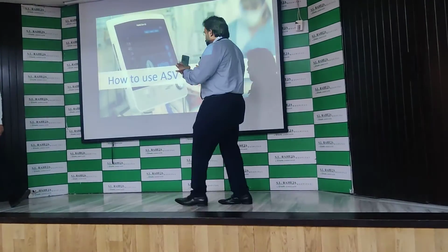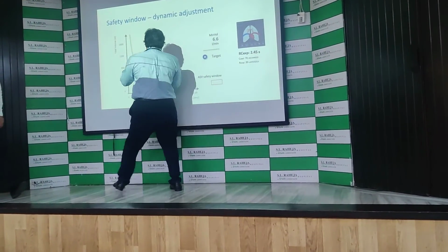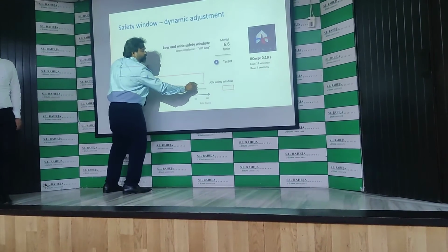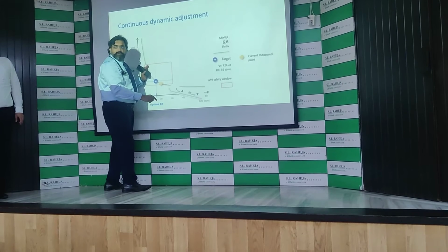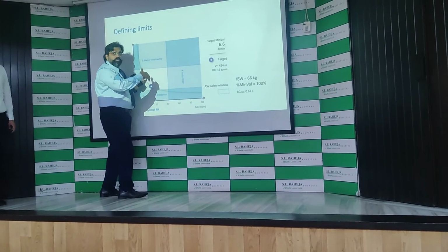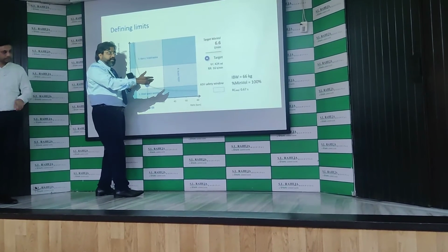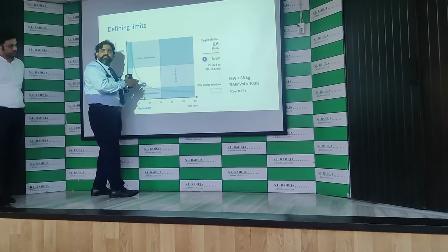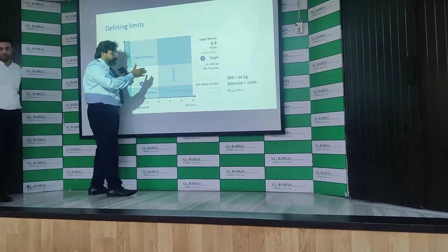So your plus sign will keep coming outside, like you are out-ventilating outside the box. If the ventilator is taking a long time to come inside this box, the patient has developed auto-PEEP. So it will try to do this.